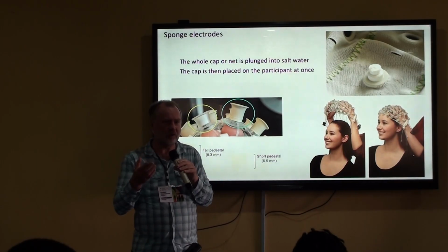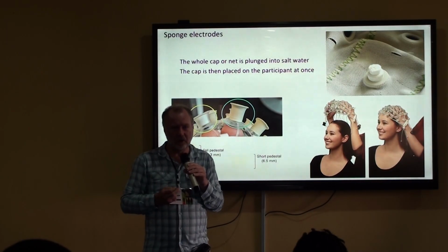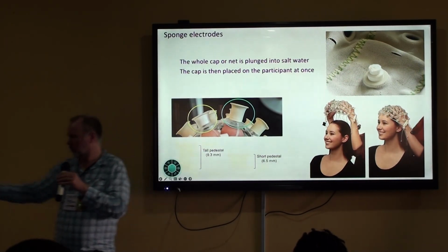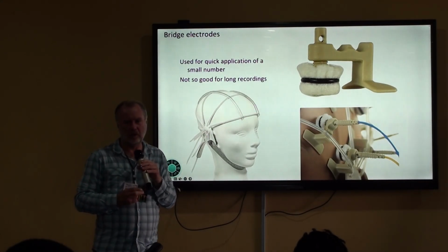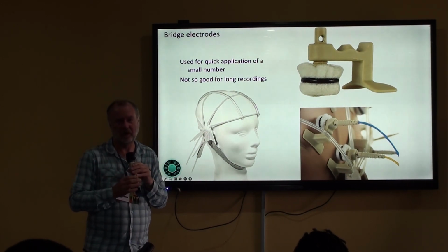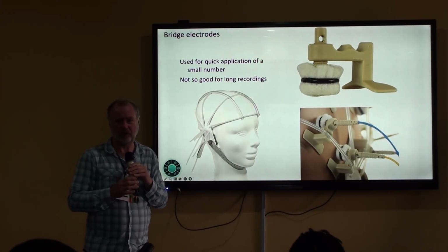And I would imagine that for clinical applications with remote monitoring, you would not necessarily need a lot of electrodes, which would again be an argument for using bridge electrodes like these. But it is something that I don't have hands-on experience with. And also, for example, how to store the signal and how to remotely transmit the signal is not something that I have experience with.